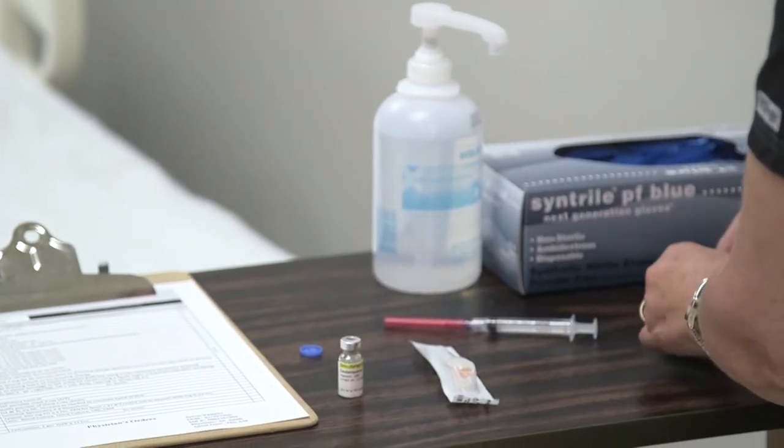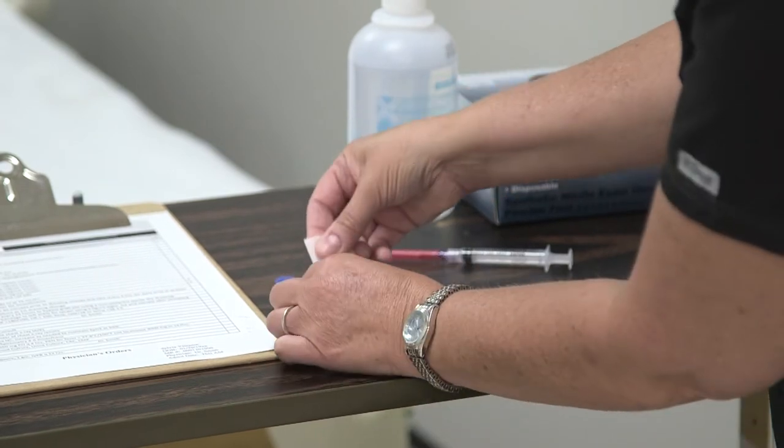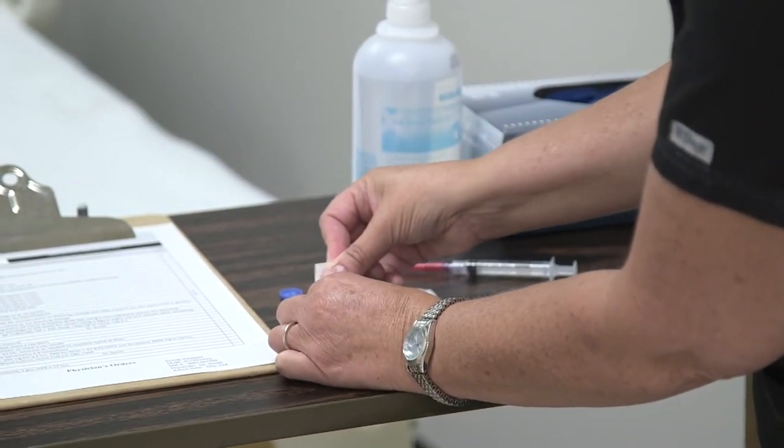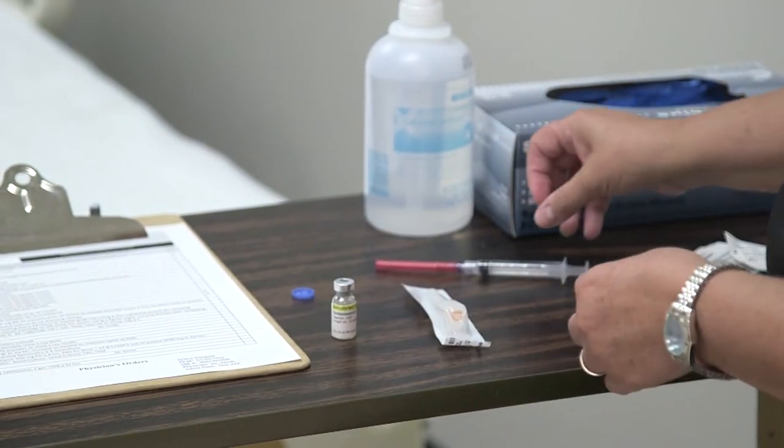And best practice, you want to vigorously scrub the top of the vial. Once that is completed, you're going to go ahead and let that dry.